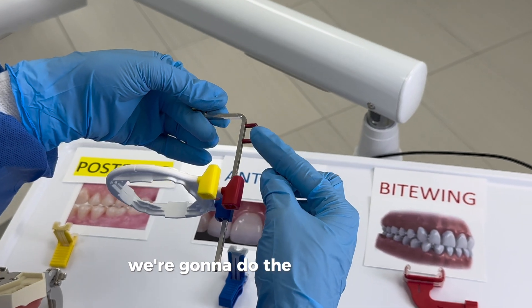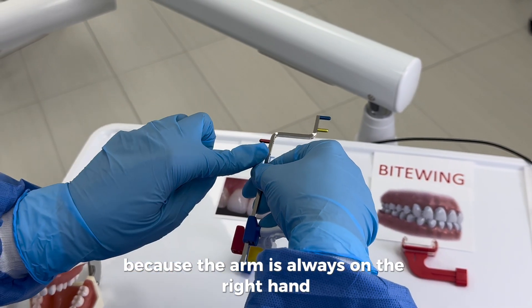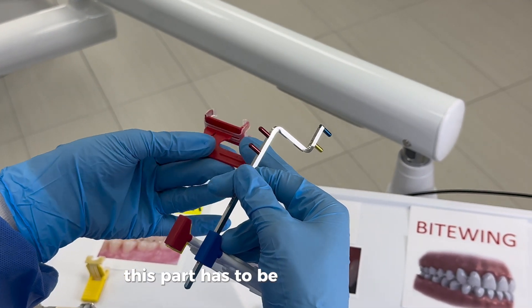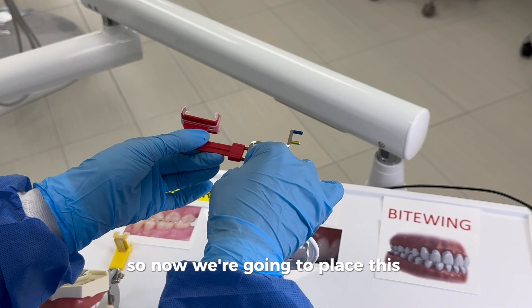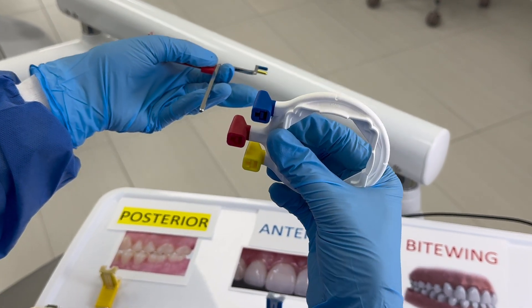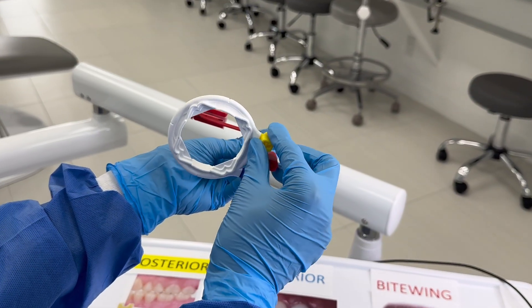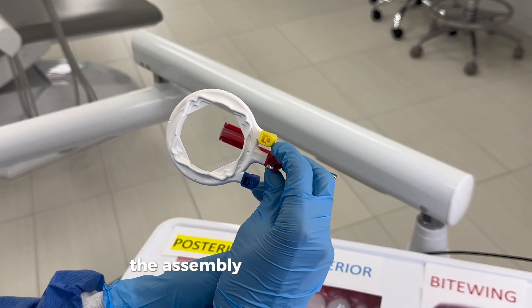Now we're going to do the red for the bite wing. We hold the arm on the right hand, with the bite block facing the opposite direction — the left — and the prongs are here. This part always has to be away from you, not towards you. We place it in. However, if you just go ahead and put the red in, the ring is on the opposite side of the bite block, so the only thing to do is put it where the bite block is and then put it in. That's the assembly for the red bite wing.